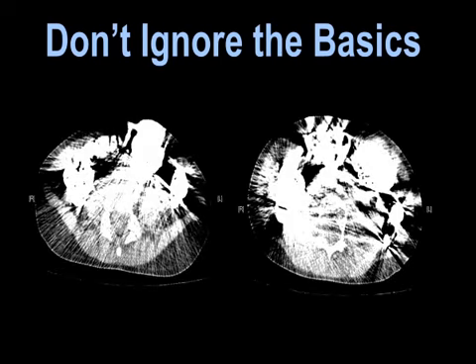All right, so for those of you who don't do CT, this is actually a CT examination. It's not a nuclear medicine study.